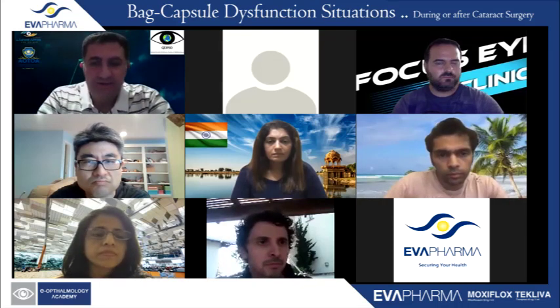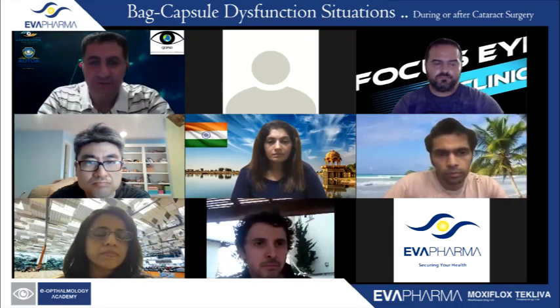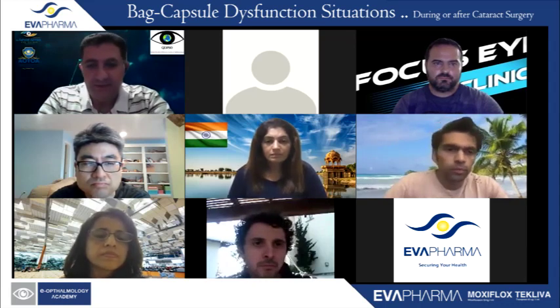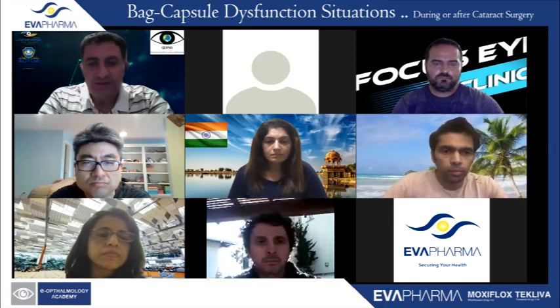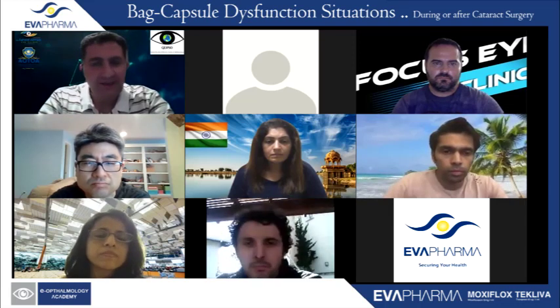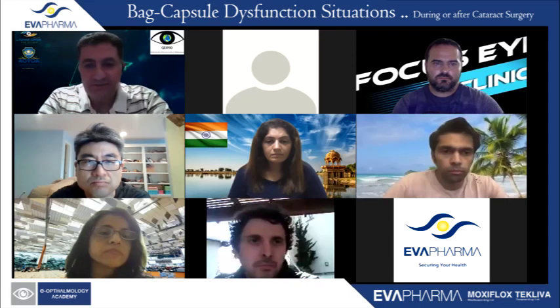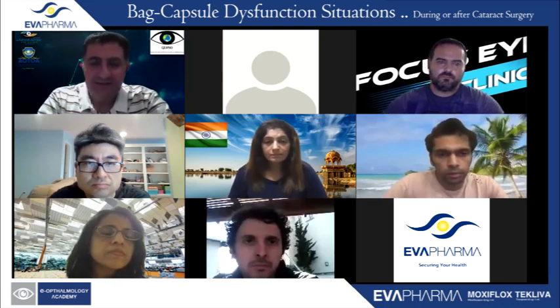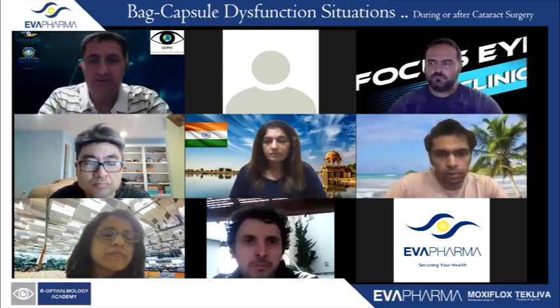I'm not going to do this. If I put a trocar, I'm going to put it posteriorly, not anteriorly, if I want to do a posterior vitrectomy instead of the anterior approach, pars plana. I am not going to put an anterior chamber maintainer, because I want to decrease all the parameters. Once I see this, the main step is not to disturb the vitreous, not to make turbulence in the anterior chamber.